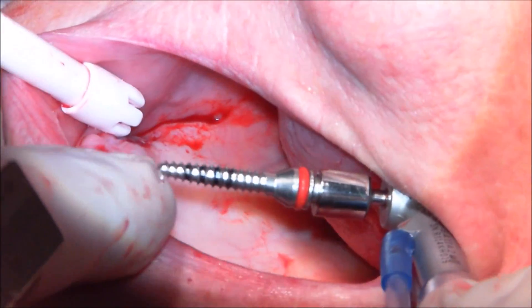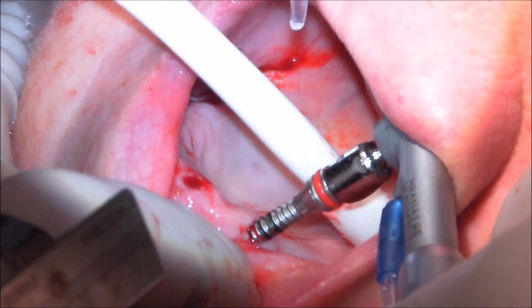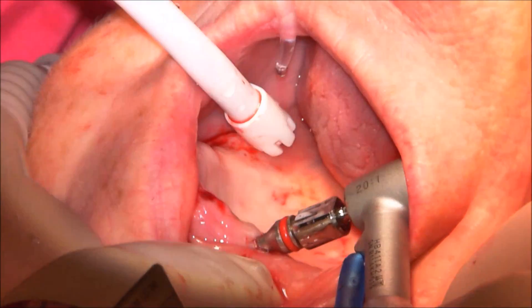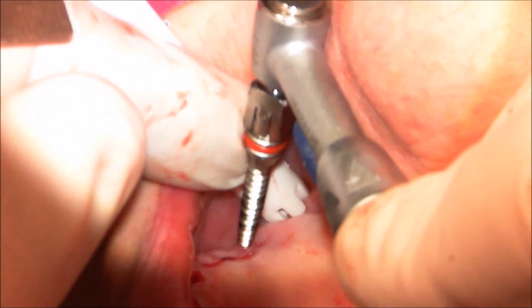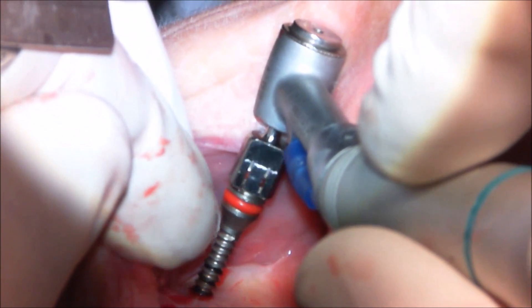Now we're moving on to the rotary expanders. I measured with that probe how deep the sites were, and by using a finger ruler I can know exactly how deep to sink the rotary expander. This just gets rotated in. We use these in progressively larger sizes to expand the site rather than continuing to drill away bone. The advantage is it makes your implant go in tighter and expands the site without losing more buccal bone — a very nice tool to have, especially in minimal bone situations.